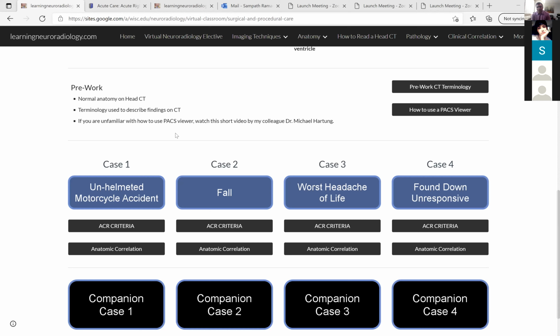It was a pleasure. There is a quick question here. I don't know if I have time to answer this one. How do we know there is a tumor underlying a hemorrhage? Very good question. That is the one I couldn't get to today, because yes, you can have a tumor which can bleed out, and the patient will present as a bleed. So you cannot assume that every bleed is just a bleed. You can have a tumor which causes a bleed. That's a really good question, and the answer is yes, there can be a tumor within a hemorrhage.